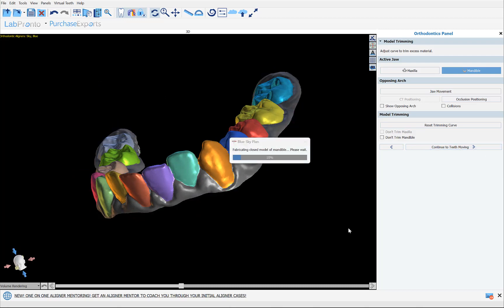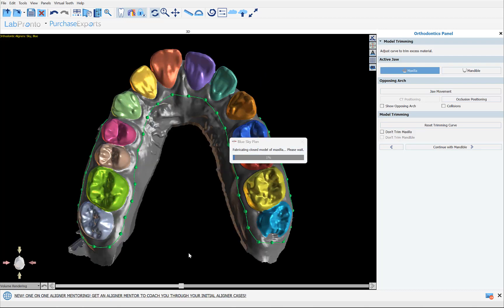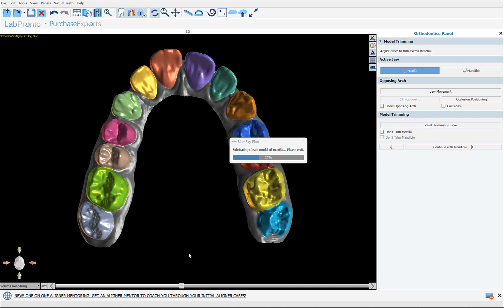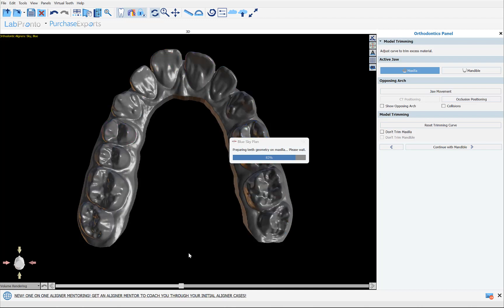The software will now trim away everything outside of the trim curve, leaving us just with the gingiva and the teeth. While this is processing — if you come across any case where the automatic annotation or segmentation of the teeth is not good for whatever reason, you can help us by sending the case to plan@blueskybio.com or just send us the STL models, and we'll use that data set to help teach the software and continually improve it for future cases.